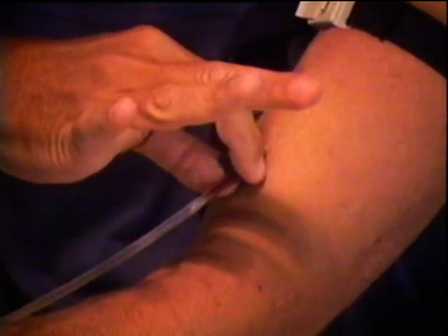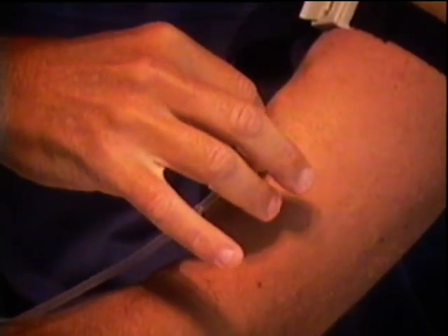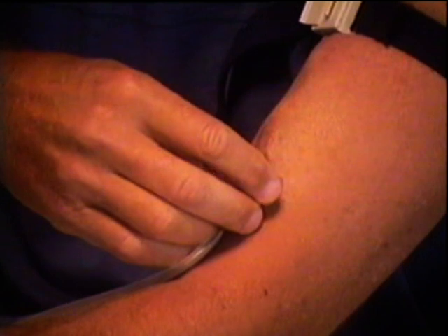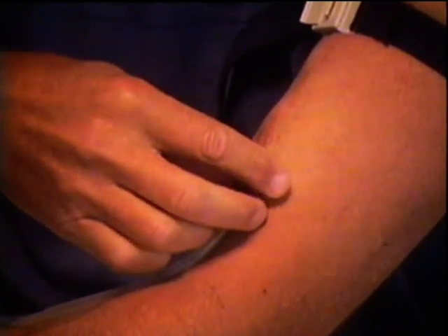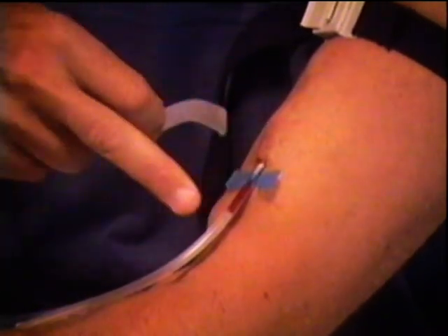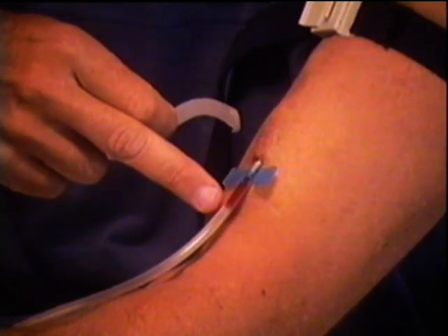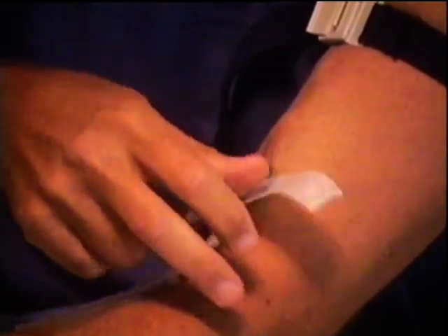You can see it pumping on the end there. You can see that pumping there, telling me that it's in the vein — that's my heart rate. So you can count those to tell you what your heart rate is. Not that you really want to.